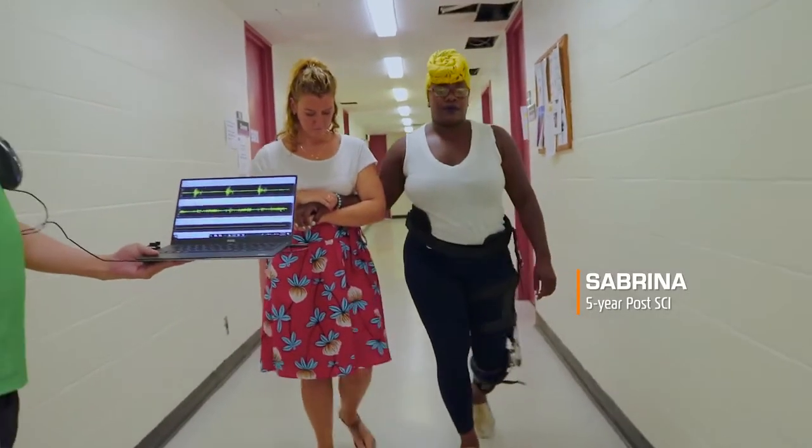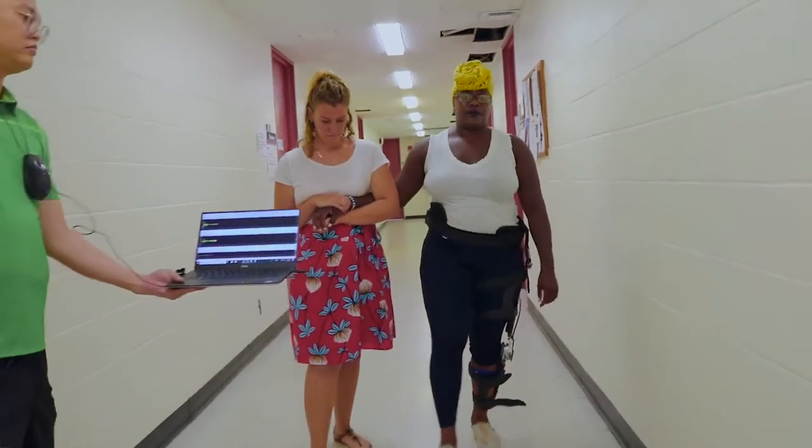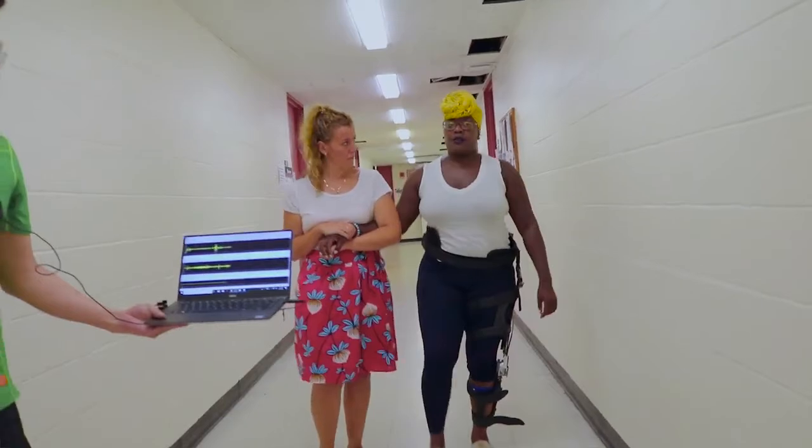It took about a minute because it's pretty easy. I'm walking a lot lighter. It's very low profile. I don't hear a noise when I'm walking. Every day use — this is perfect.